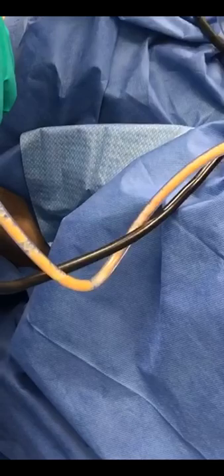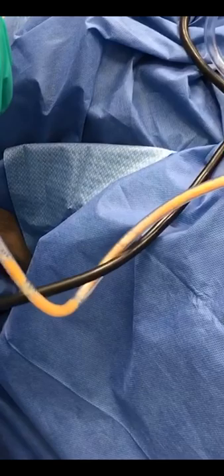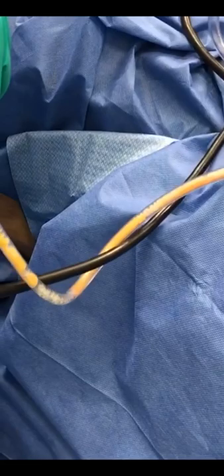The yellow, beautiful fat that we're taking out — and like I said, she doesn't really have much. This is a very gentle aspiration with my power-assisted liposuction, so it's less trauma, faster recovery, and less risk of perforating any organs, because I barely move my hand and just let the electric tool do the work.